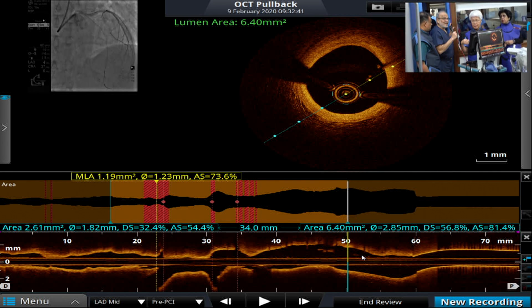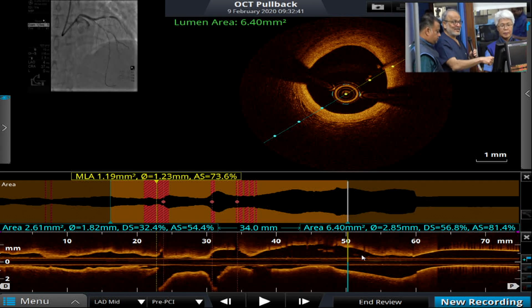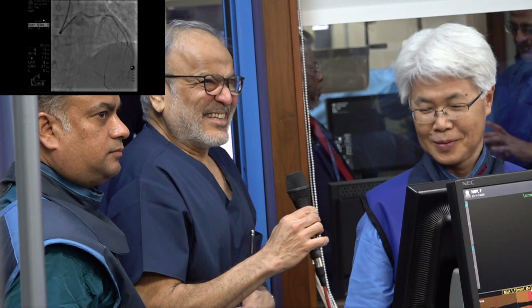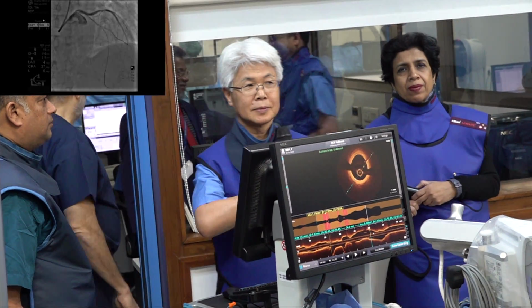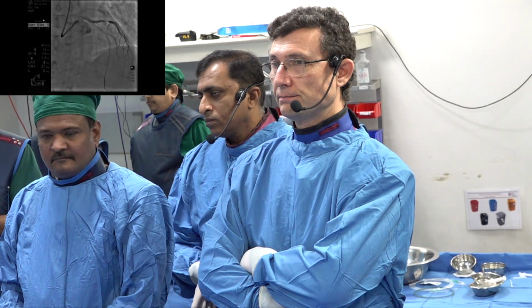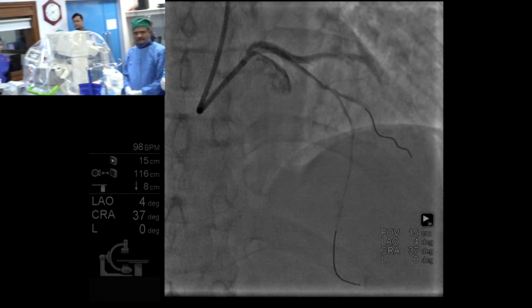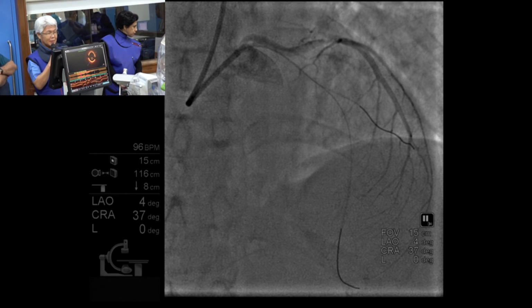It is very funny to take a 2 millimeter stent, you know. Yes, but it especially works in these middle arteries. By rule, I never do less than a 3.5 stent in the proximal LAD. In the proximal mid LAD, I never do less than 3.5. Yeah, there are lots of stent sizing approaches. Someone recommends EEL, but try to think about the final diameter of the stent.